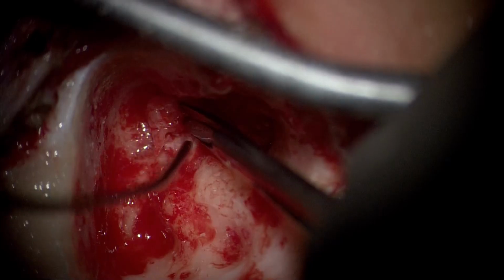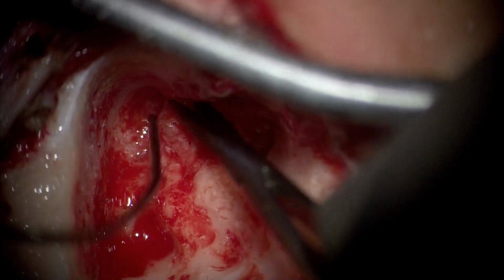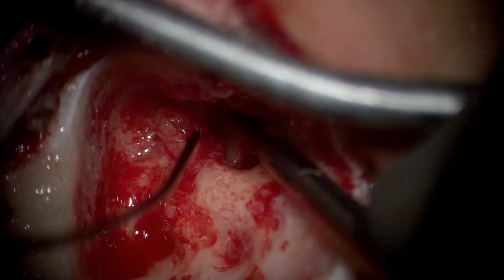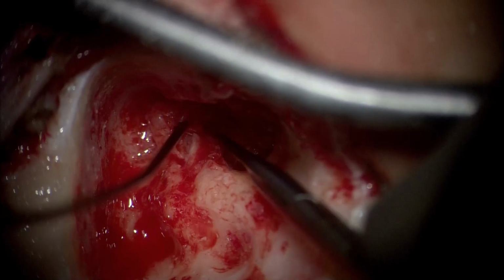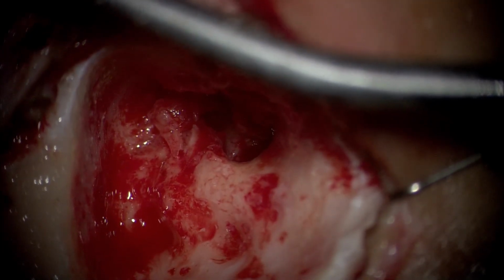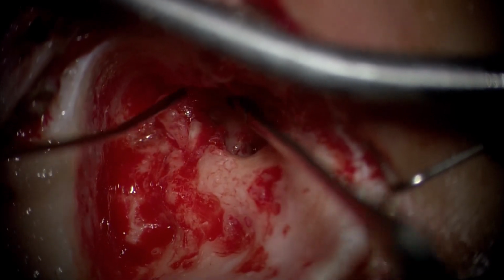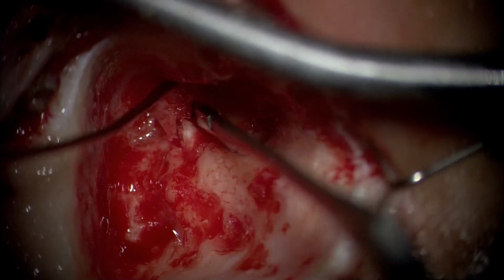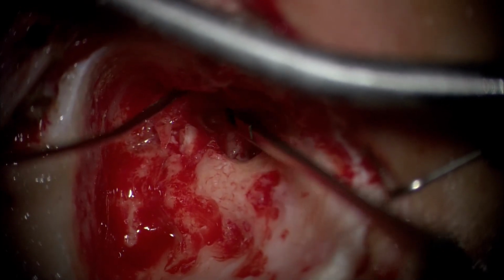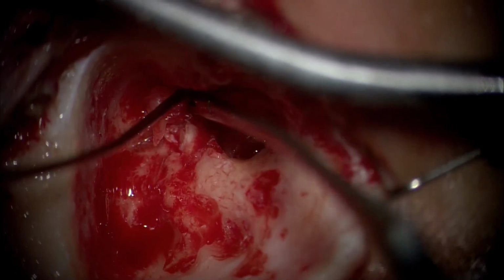Now, with gentle mobilization, we get an idea that this is not a bulbous facial nerve. Also, one can see landmarks that though we are medial to the short process of the incus, on slight mobilization and contact, we see that the epithelium starts to give way. But we do not know the status of the facial nerve medial to it. So, what we'll do is clear the incus, removing the incus anteriorly, as well as the head of the malleus, using a malleus nipper. We assume that some remnant of the head would be attached to the incus.